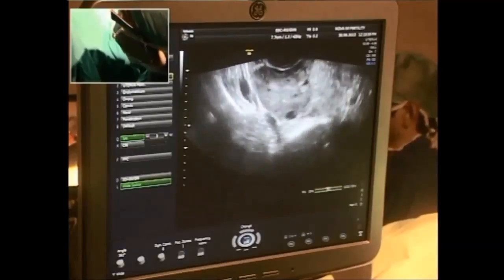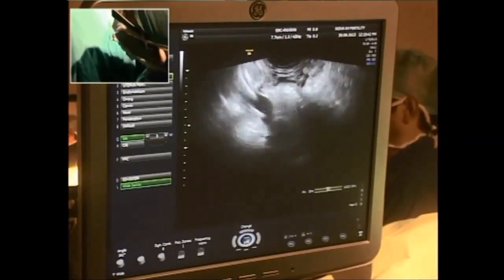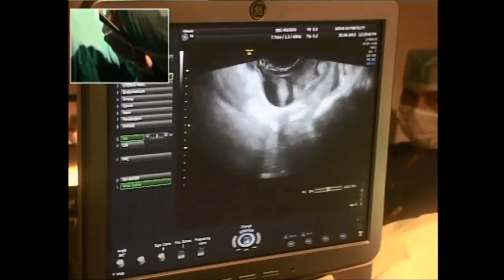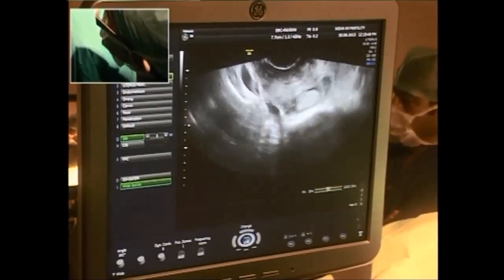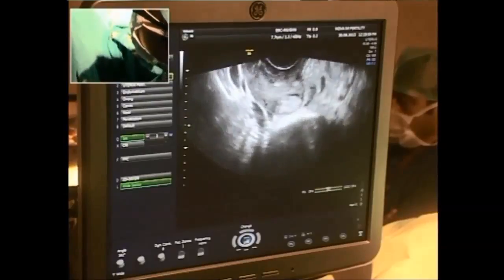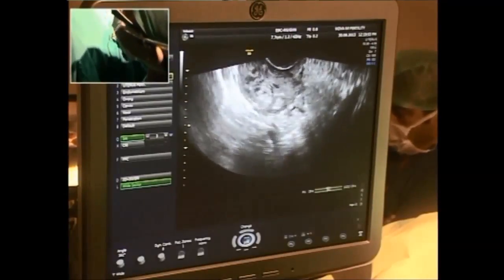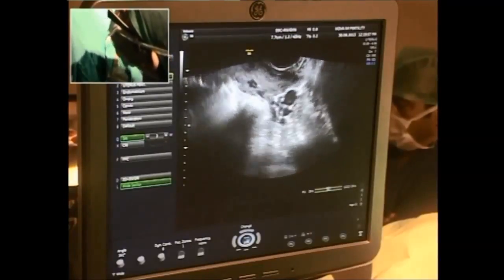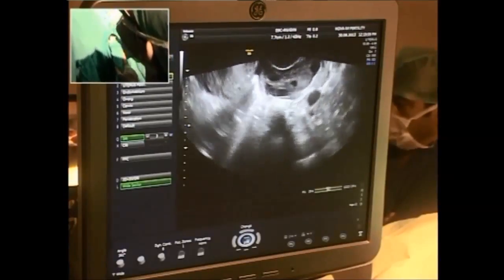Once the pickup is done, I'm going to check both ovaries to be sure I've not left any hidden follicle anywhere. If you see any follicle that's less than 12mm, please don't bother going into it — in all possibilities it's going to be an immature egg and will not lead to any fertilization.